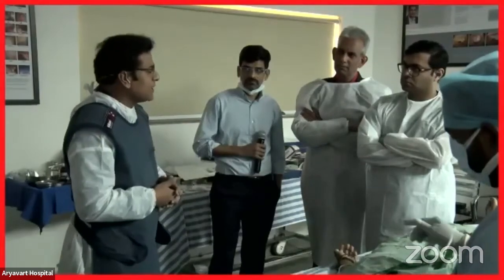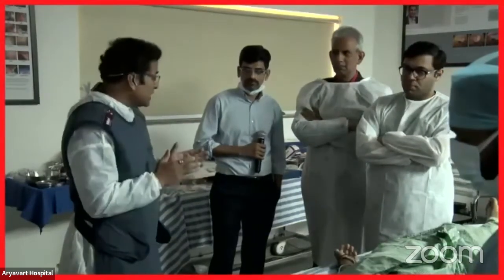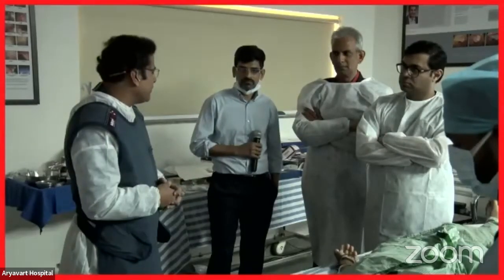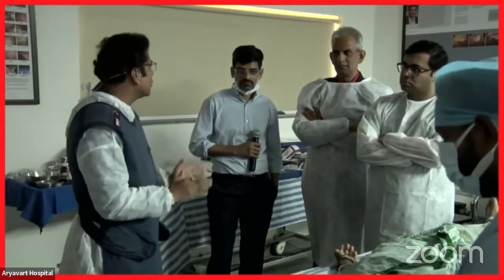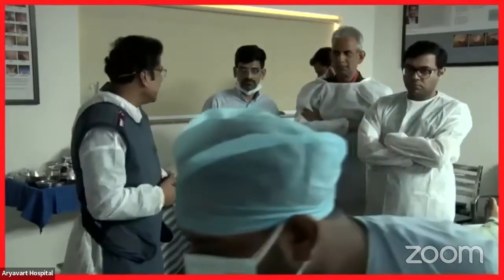What is clear is that reintervention rates are higher with duodenal stenting. If expected survival is more than 3 months, the stent is likely to get blocked and you will need to redo the procedure. That's where US GJ or surgical GJ would be better than a duodenal stent.